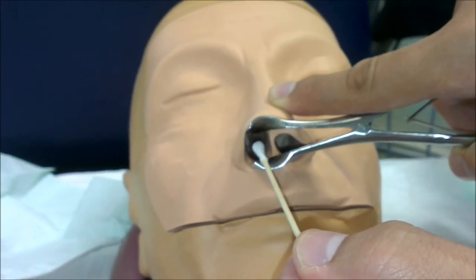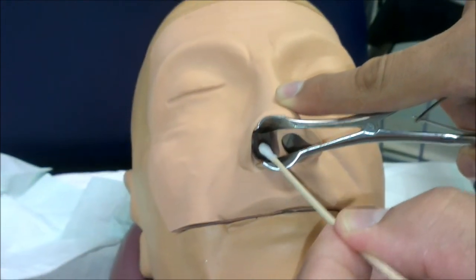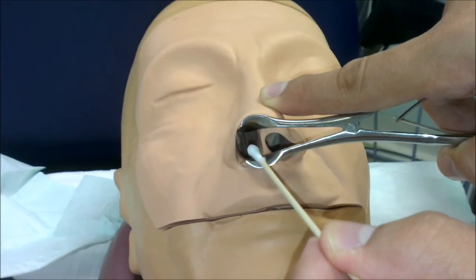Please make sure and try not to touch or contaminate your samples with the anterior nasal floor while coming in and coming out.